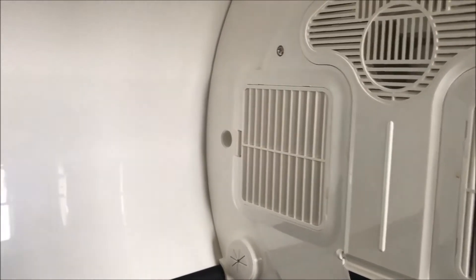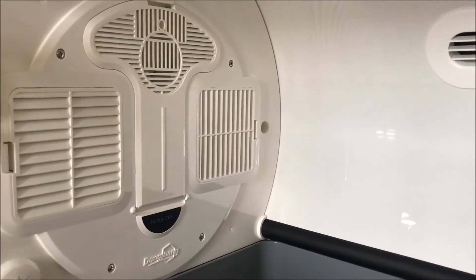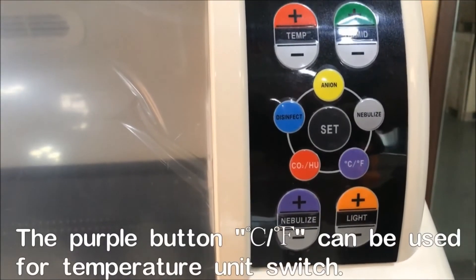This ensures 0.8 degrees tolerance inside, which is the most accurate temperature control system in the world in this industry. On our control panel, we have the switching button for Celsius and Fahrenheit degrees.